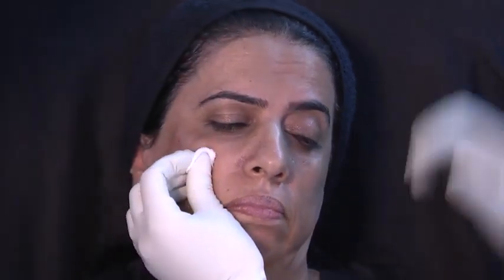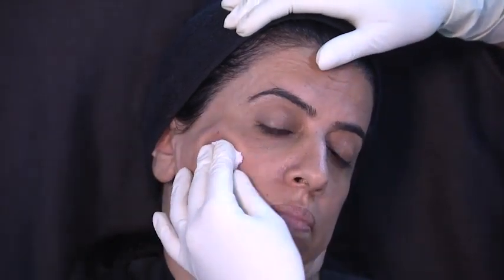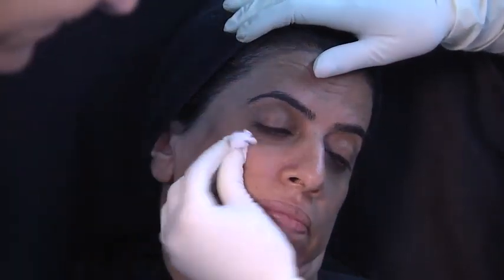Right, okay, so remember, I'm not seeing exactly what you're doing, but the products are, so he's just injected over the zygoma, and then now he's putting superficially some of the product.